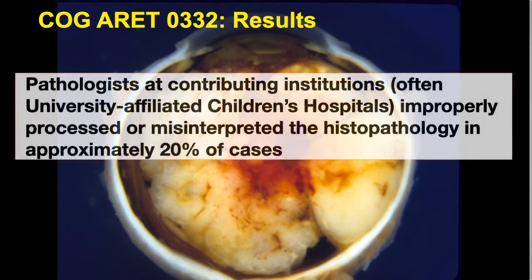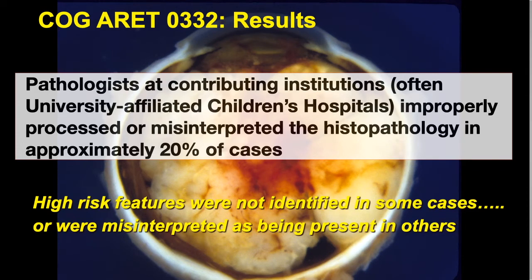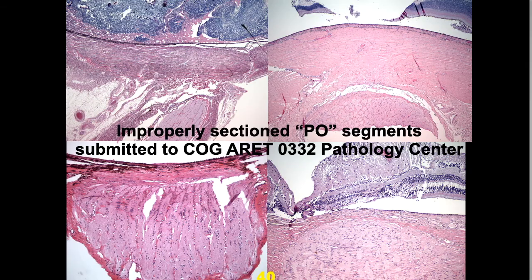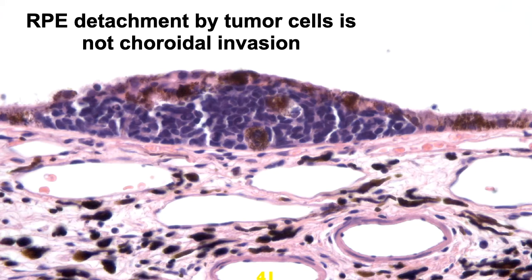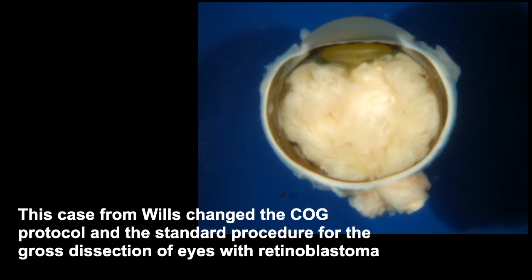The COG study also found that contributing pathologists at institutions — often university-affiliated children's hospitals — improperly processed or misinterpreted histopathology in about 20% of cases. High-risk features were not identified in some eyes and were misinterpreted as being present in other eyes. Some PO segments submitted did not include the optic nerve head, which is what we need to look at carefully. Other pathologists misinterpreted sub-RPE tumor as choroidal invasion — it's not choroidal invasion, it's not behind Bruch's membrane — and others misinterpreted artifacts as contamination of the choroid.